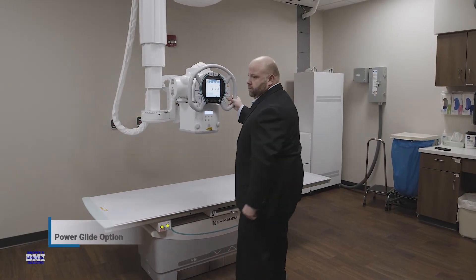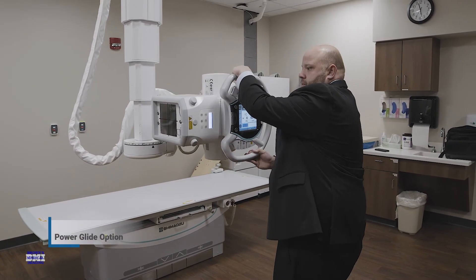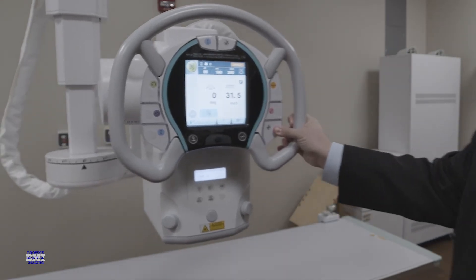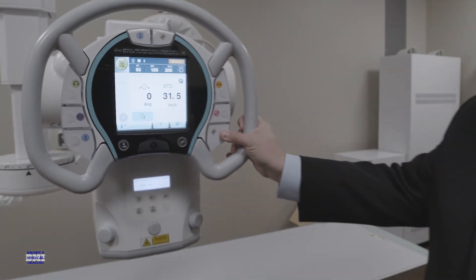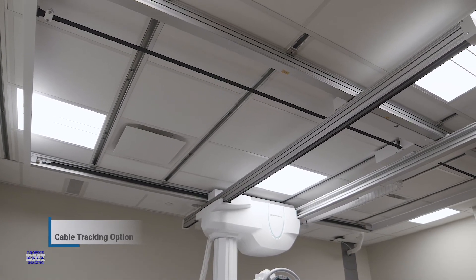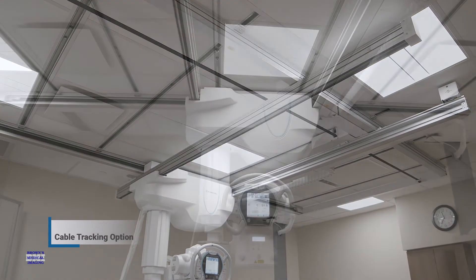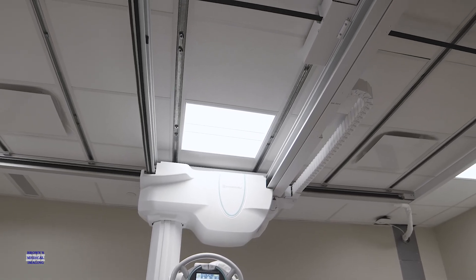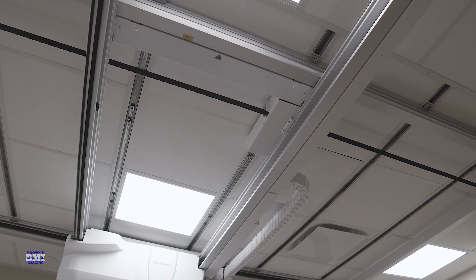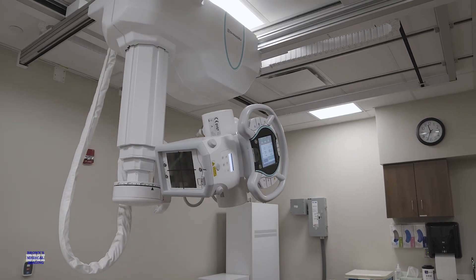The new power glide option is like a dream come true for technologists. With its motor-driven capabilities, it will make positioning the x-ray tube quick and effortless. It also significantly increases patient throughput as you can now manage more scans in less time. The optional cable tracking from X-Ray Solutions allows for free positioning of the x-ray tube support. By bundling cables inside the track and integrating it with the ceiling rails, you can enjoy improved mobility and a stylish appearance in your examination environment. Cable tracking makes organizing cables easy and helps to create a professional look while also maximizing space efficiency.